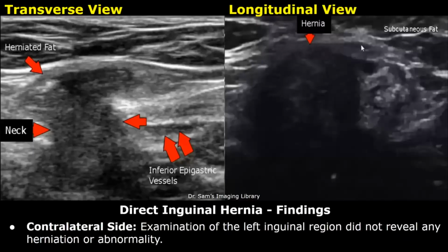The contralateral side, which is the left side in this example, since the hernia is found on the right side. Examination of the left inguinal region did not reveal any herniation or abnormality.